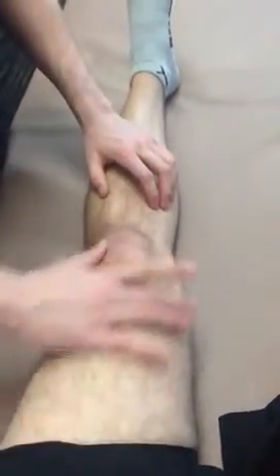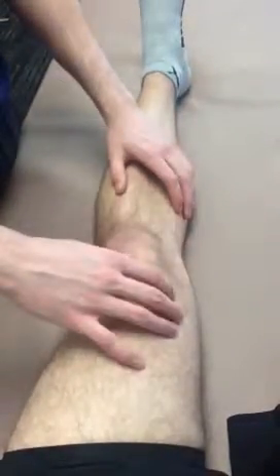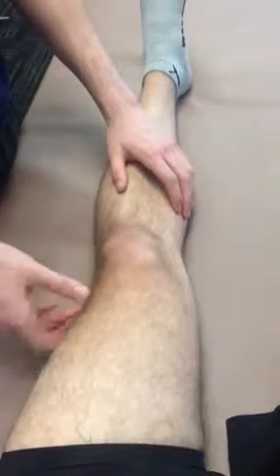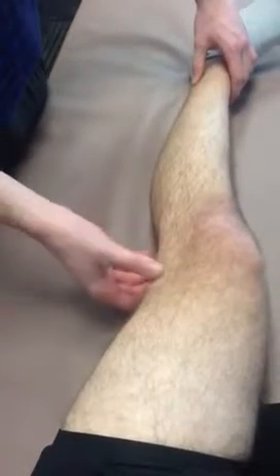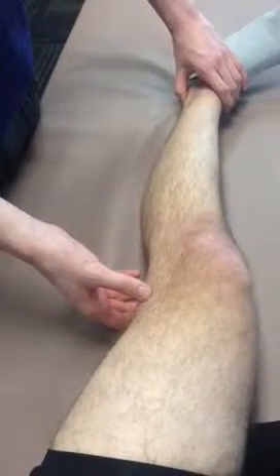I would check light touch perception of the area, make sure that the treatment area is uncovered, nothing's blocking the E-stim pads from working. I would check light touch, make sure they're able to feel that. I would check capillary refill, just pushing down and making sure that their skin, when it turns white, comes back to the original color. For this area, I could check two places for pulse. I could check the popliteal artery back here, and I could check the dorsal pedis artery down here for pulse and make sure that they don't have any abnormalities there.